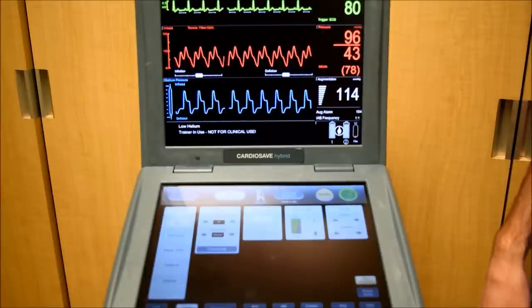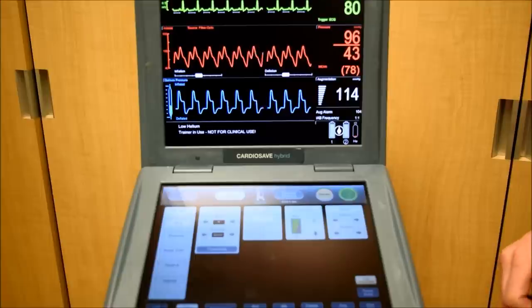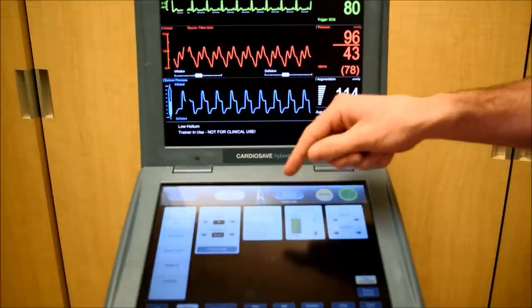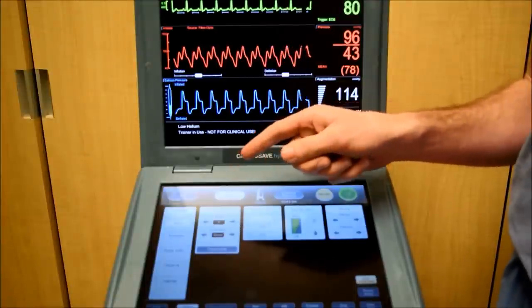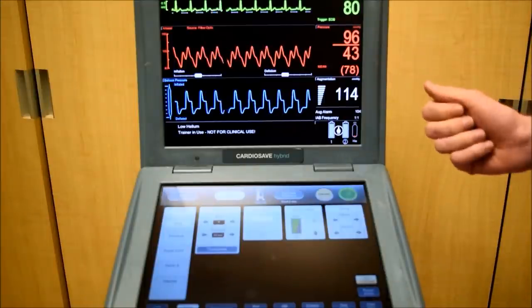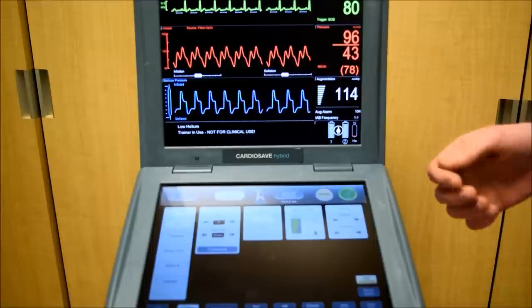I'd like to talk about the trigger source for a minute. Your trigger source can be found on the left side of the lower monitor. Right now it's in ECG, which means the balloon is timed based on the ECG. The next column over, labeled sources, allows you to adjust which lead your ECG is reading off of. Right now we're on lead 2. Overall, ECG and lead 2 is the most common trigger source used.